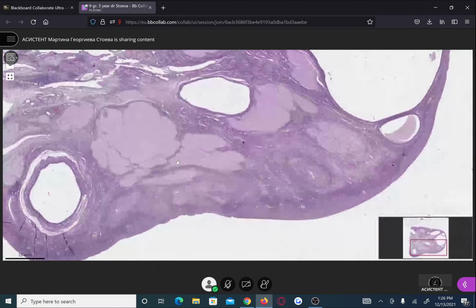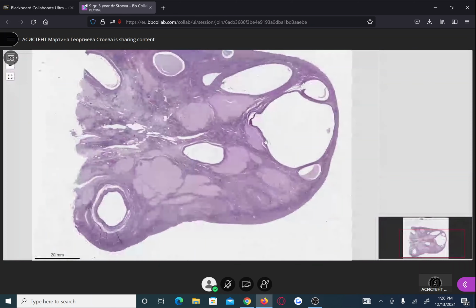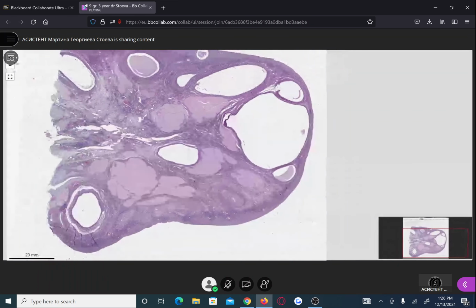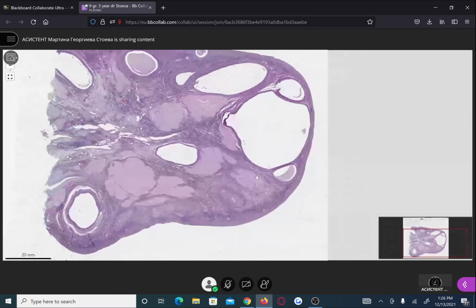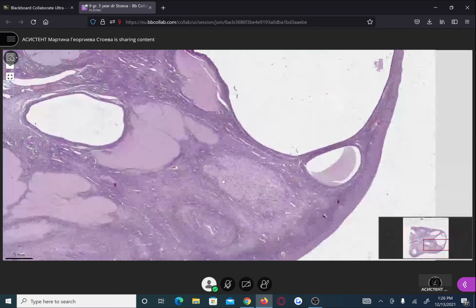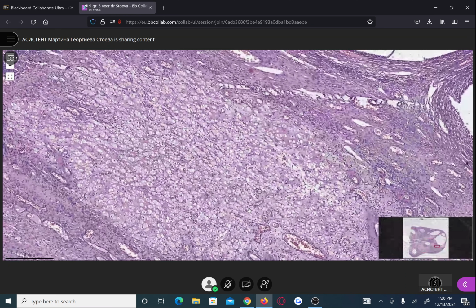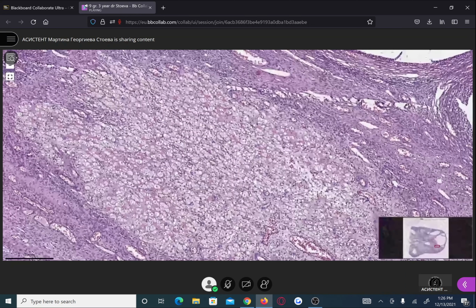You know that in between the ruptured follicle during ovulation and corpus albicans, there is a middle stage of corpus luteum, but unfortunately here on the slide we can't find corpus luteum to show you how it looks histologically. Maybe here there is something, but this is an end stage, not the classic manifestation of corpus luteum.